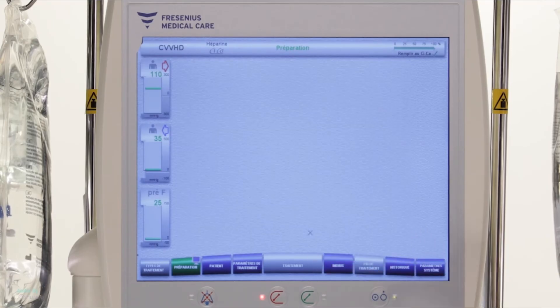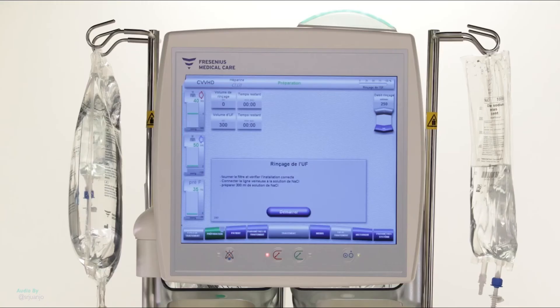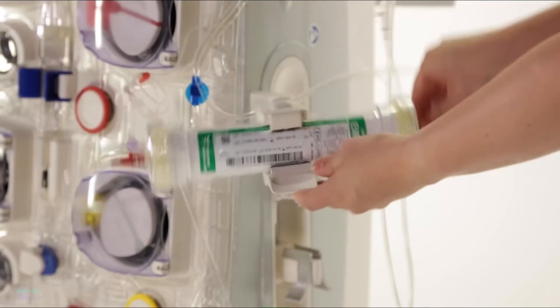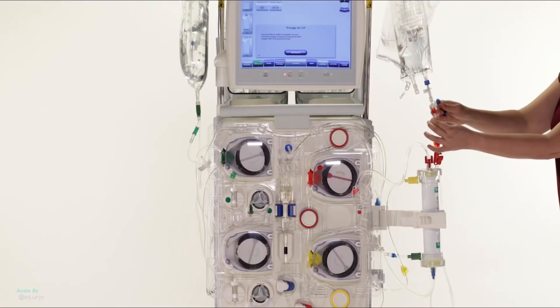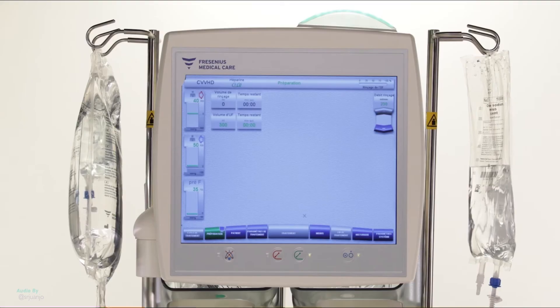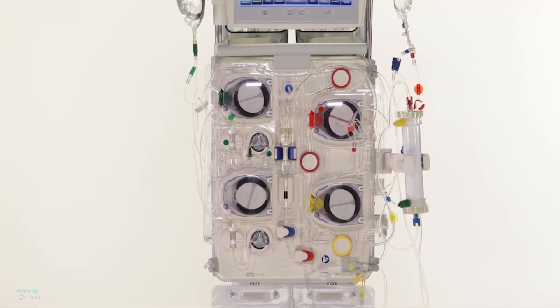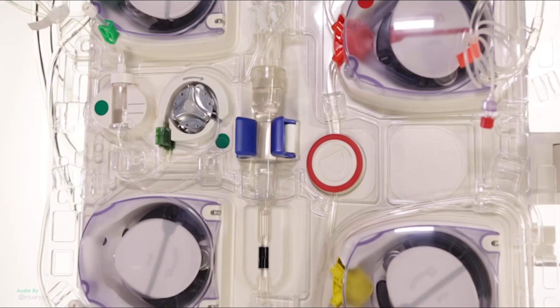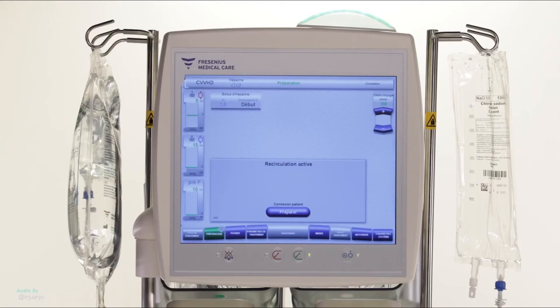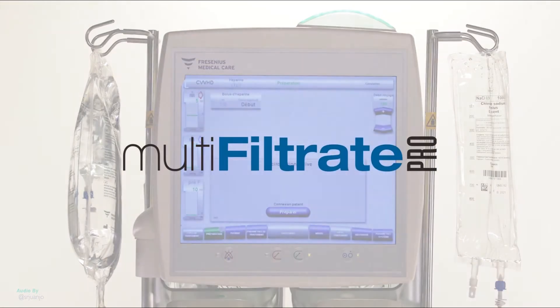Continue by clicking Start to start filling the tubing system. The treatment parameters will appear on the screen. Check the preset treatment and adjust if necessary. The circuit is filled when the message 'UF Rinse' appears on the screen. Turn the filter. Connect the return line to the sodium chloride bag and unclamp it. Open the three-way tap. Press the Start button to start the UF Rinse. A couple of tests are processed to check that the circuit is properly installed. The Multi-Filtrate Pro adjusts the level in the bubble catcher. At the end of the priming, the Multi-Filtrate Pro automatically puts itself in recirculation mode while waiting for the patient connection. Only the blood pump turns. The Multi-Filtrate Pro is ready for the patient connection.